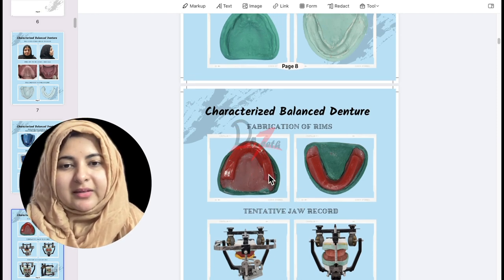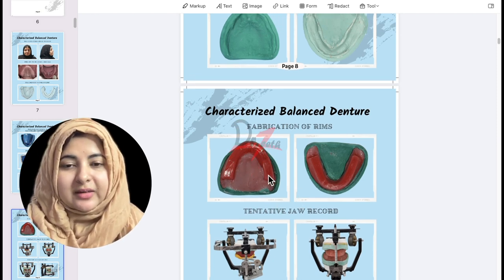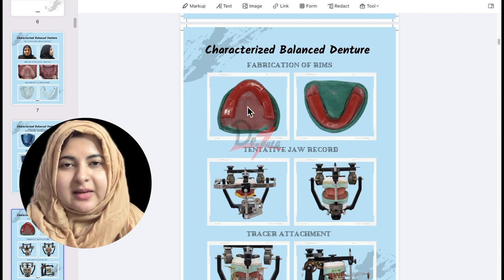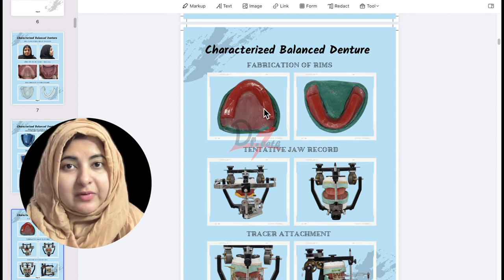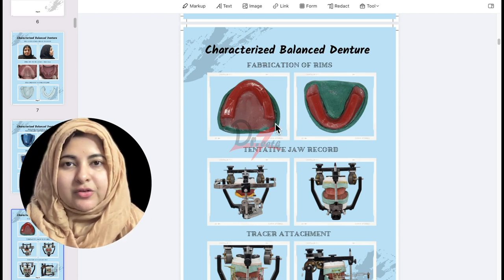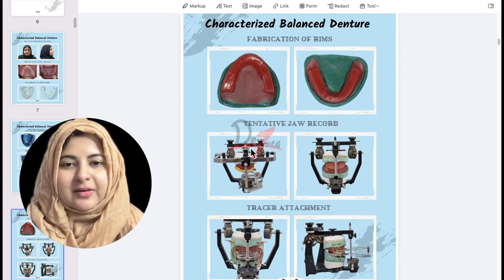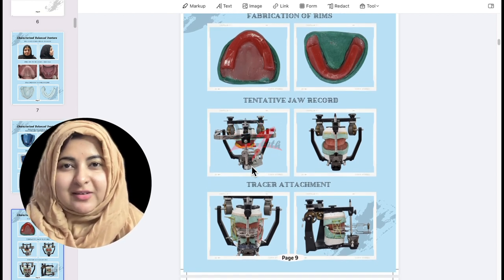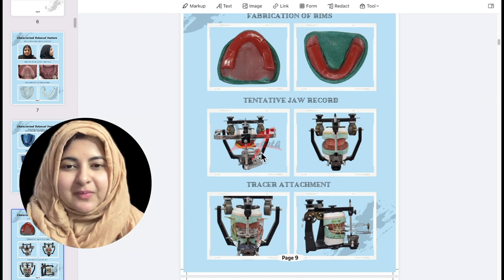Rims are then fabricated on the master cast following ideal guidelines. After fabricating the rims, we try them in the patient's mouth — first adjusting lip fullness, then lip visibility. Then we use a Fox plane and take a face bow record. This is a tentative jaw record, which we are going to verify again later by putting tracers.